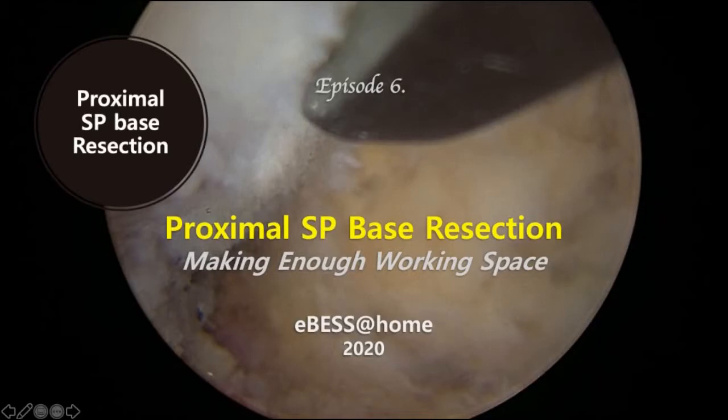Hi, now you are watching eBESS Education at Home. In this time, we are going to get the concept of making working space wider enough. Resecting the SP base protrusion is a very simple step, but one of the most important procedures to make the surgery easy and smooth.